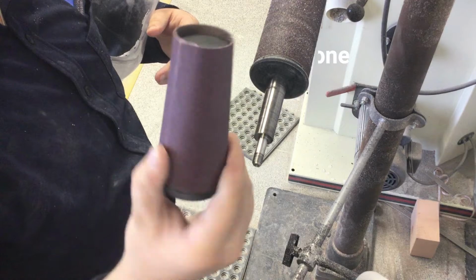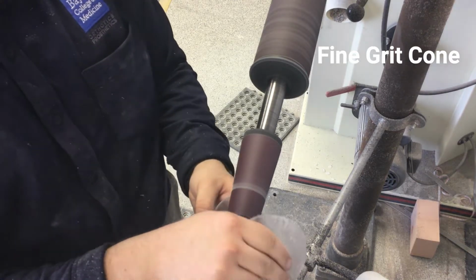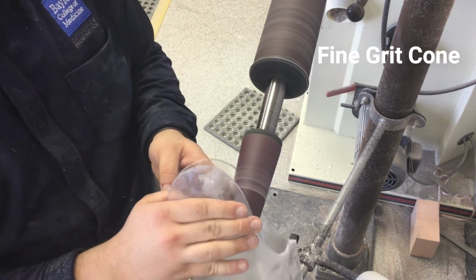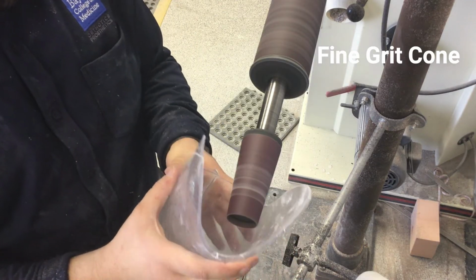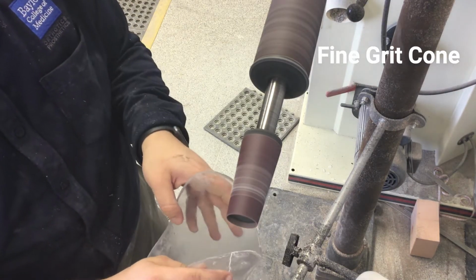Next, we will use the finer cone to take away the 90-degree edges and to create a smooth transition from the inside to the outside of the socket. We are trying to ensure the bony and muscle anatomy is captured in the socket while not causing sharp or rough edges to damage the patient's skin.